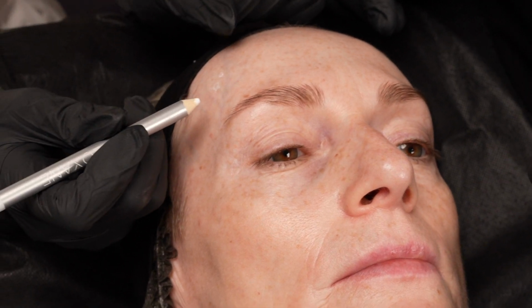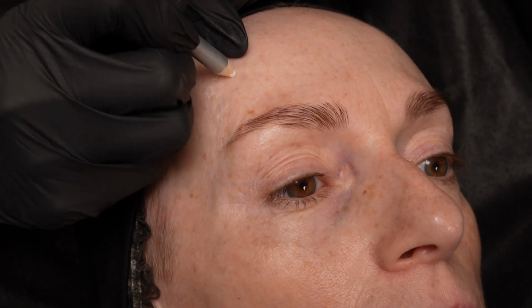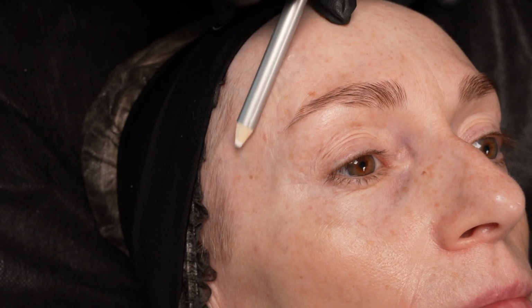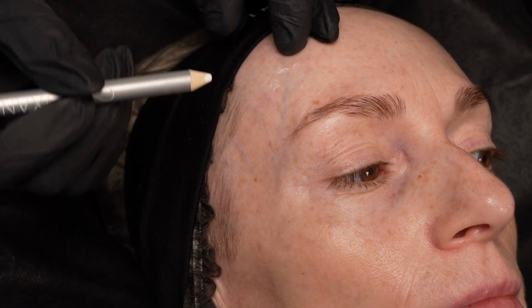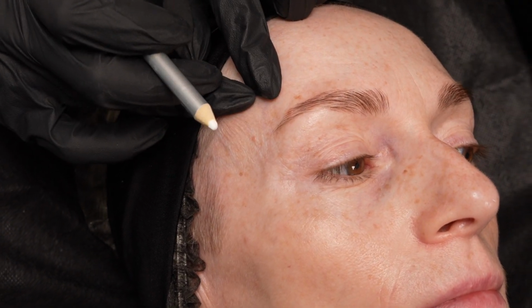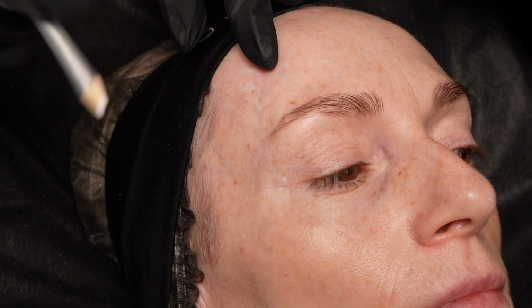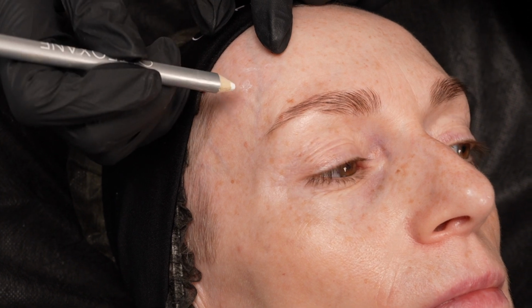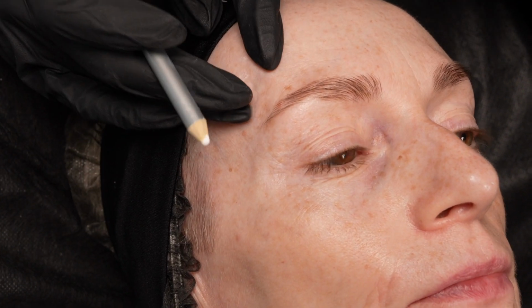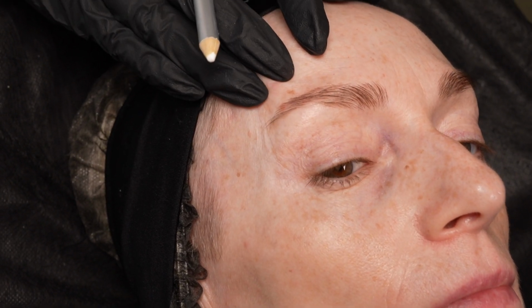Я делала точку вкола. Может быть, не здесь, может быть, чуть выше. И, получается, канюля заходила вот так вот. Ну, вообще, если вы делаете именно с гребня, I don't go up because of the curve of the shape. Да, потому что если с гребня, вы зайдете немножко центрально, сложнее, потому что меняется изгиб, и канюле будет трудно перейти. Поэтому через гребень лучше всегда точка вкола на самой выступающей части, у самой вас переход. Вы ее прям чувствуете, если два пальчика на гребень положите, вы чувствуете переход.